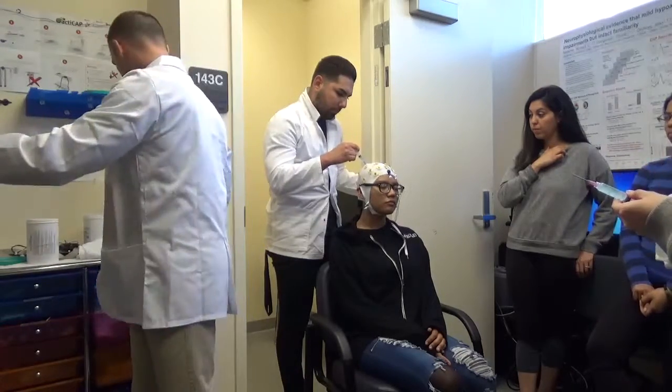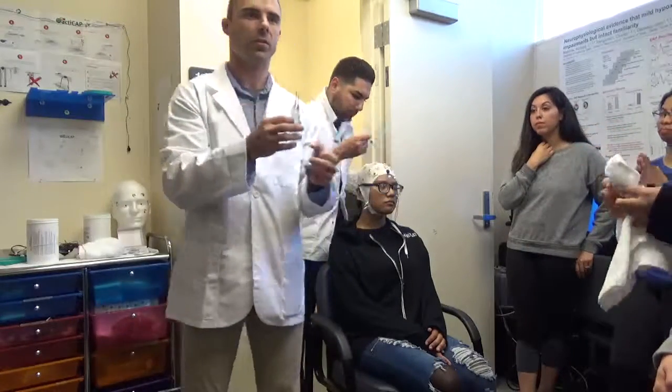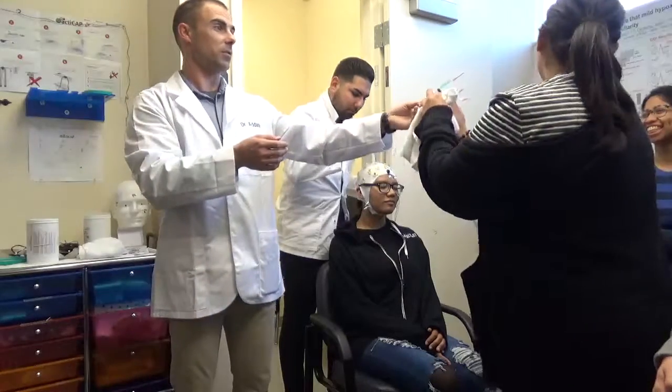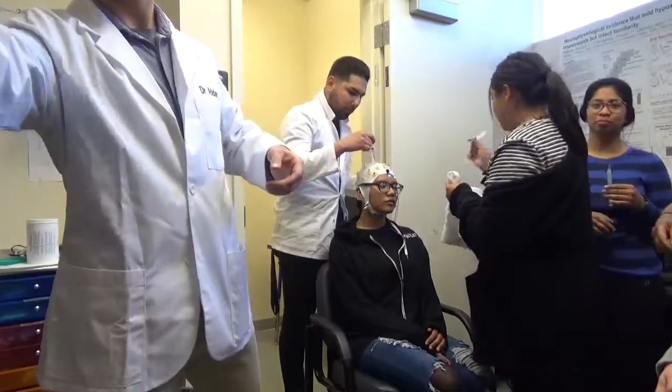Okay, so we got this one ready, and this one's ready. If anybody wants to help fill these with gel, we're like 3. Very soon. If you guys want lab coats, we can pass those over. I think we have a use for some of them.